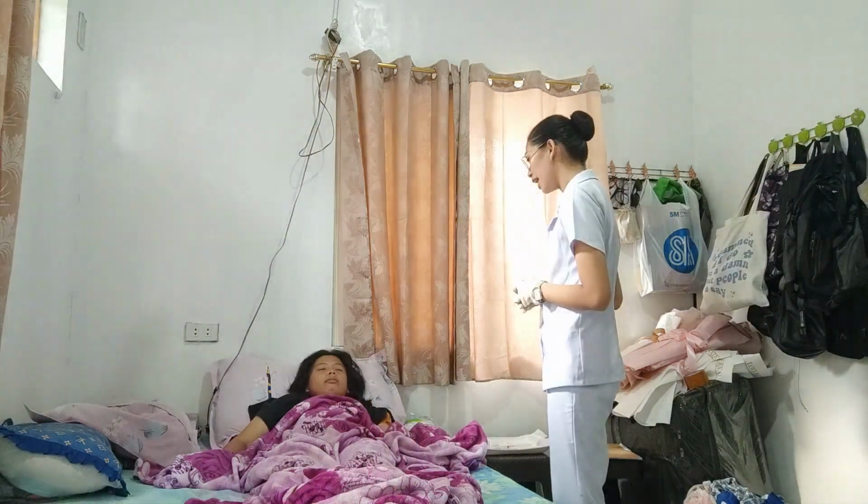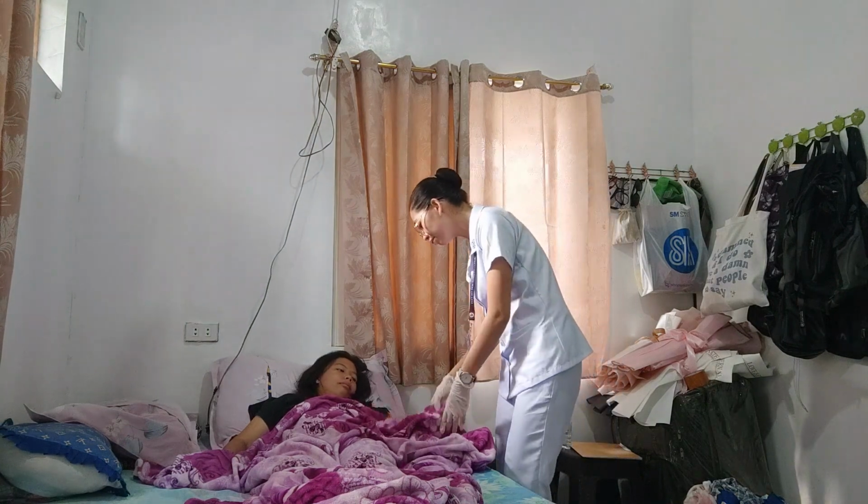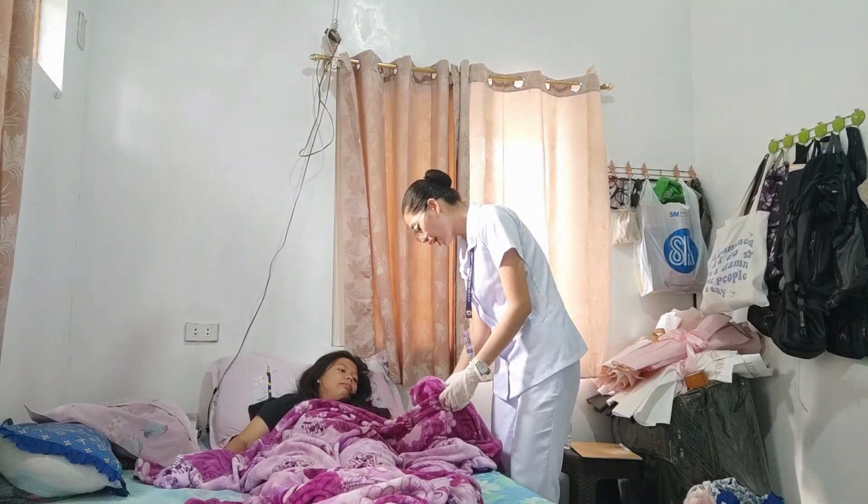After donning the gloves, we are going to proceed by introducing ourselves to the patient, identifying the patient's identity, and explain to the patient what the procedure and medication is all about. Okay, ma'am, good day. My name is Nika. I will be your student nurse for today. Can I please see your wristband, ma'am? Can you please state your name and your birth date?